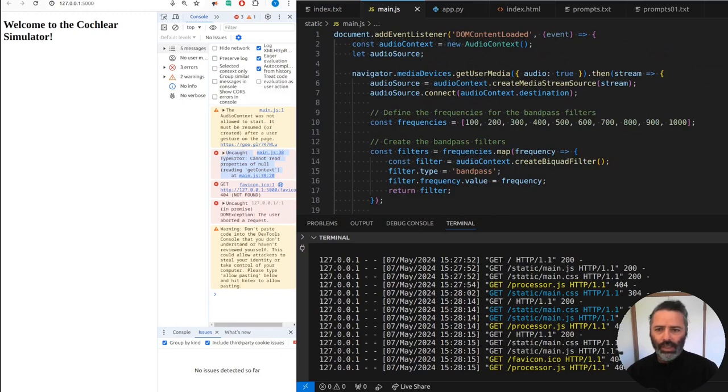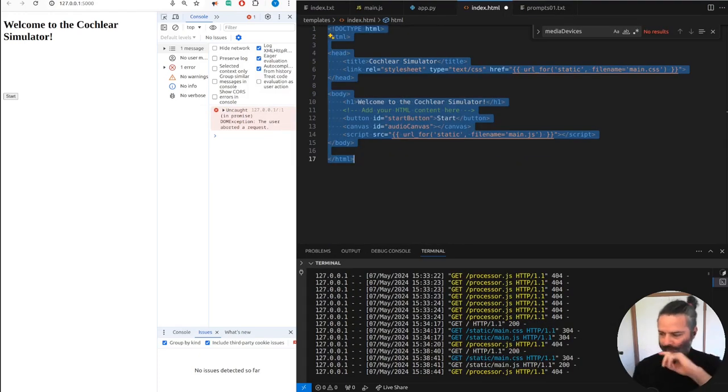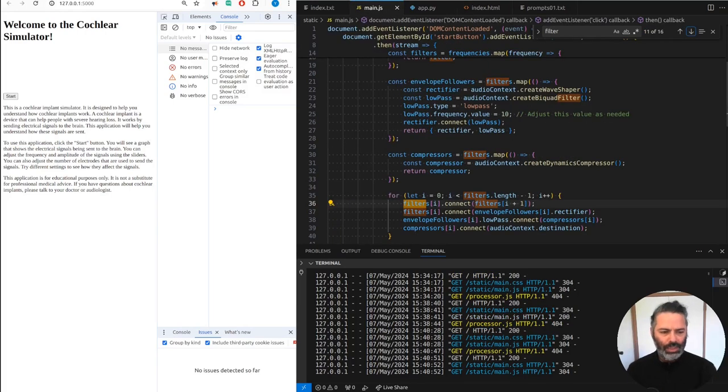Right, we added an event listener, policy of the browser, okay. Yeah, we need a start button. Can we have a different type of interaction? As long as this microphone is not filtered, so you can hear noise from the outside and stuff. Okay, similar to the start button, you'll see a graph that shows electrical signals being sent to the brain. That's quite ambitious, isn't it? Yeah, we're connecting filters in a series.